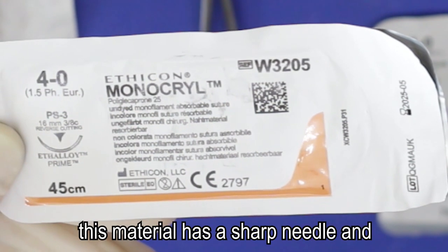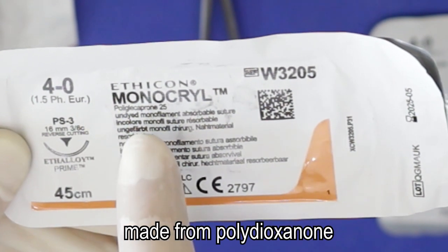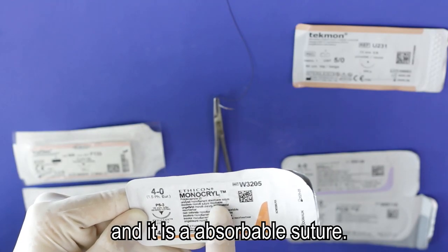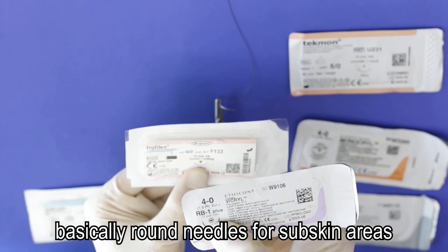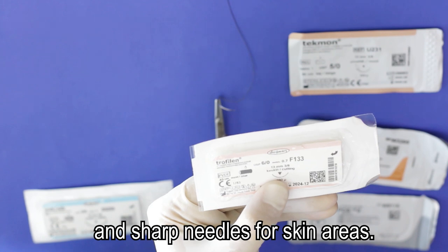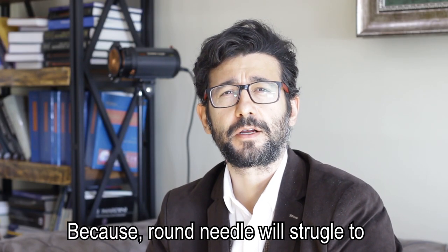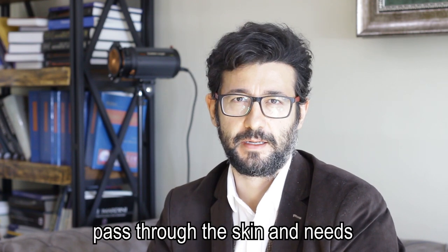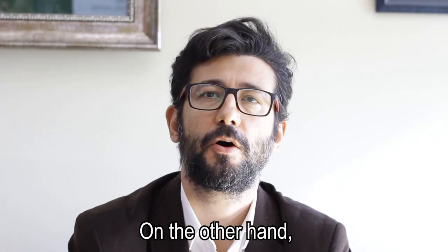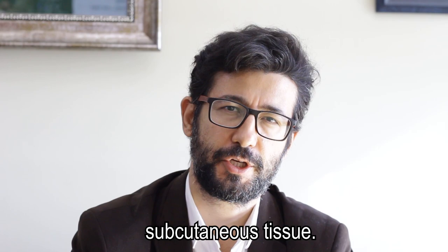For instance, this material has a sharp needle and is made from poliglecaprone, and it is an absorbable suture. We prefer basically round needles for subskin areas and sharp needles for skin areas, because a round needle will struggle to pass through the skin and needs so much force to do that. On the other hand, a sharp needle can tear the subcutaneous tissue.